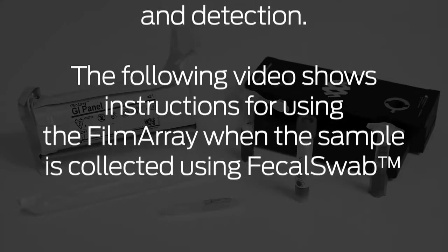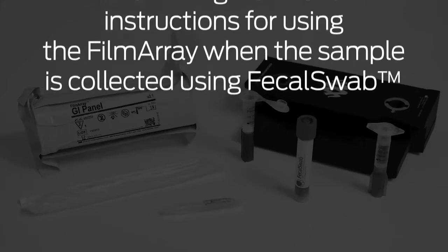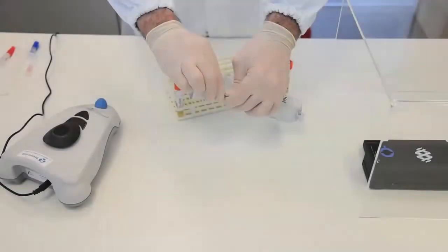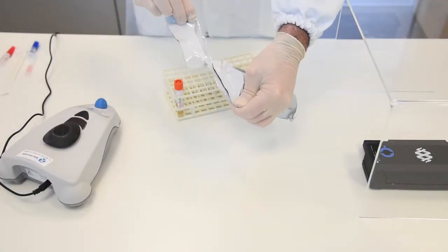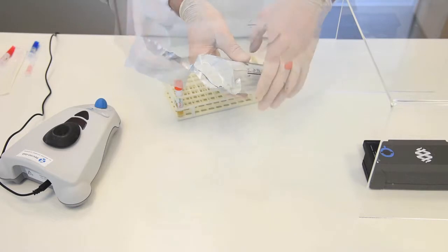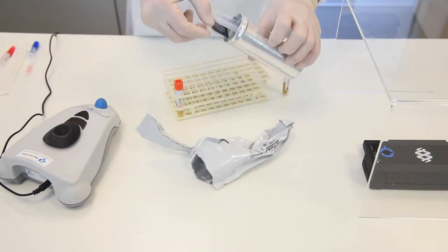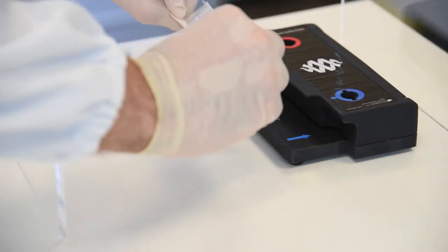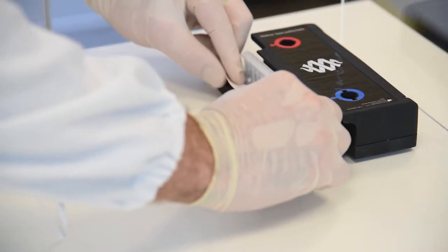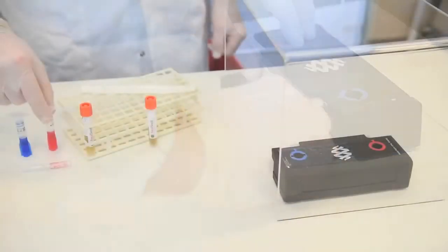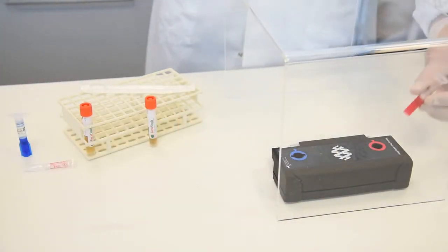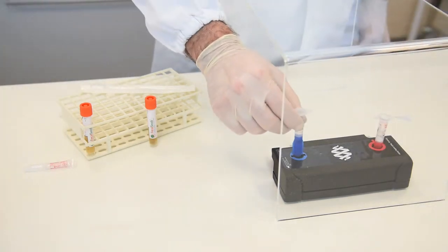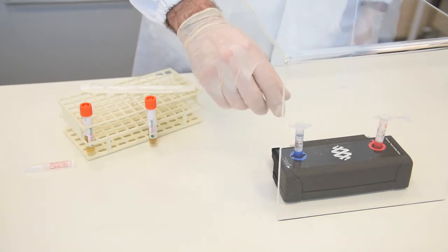The following video shows instructions for using the FilmArray when the sample is collected using fecal swab. Step 1, Prepare pouch. Open packaging and remove pouch. Insert pouch into pouch loading station. Place sample injection vial into red well. Place hydration injection vial into blue well.